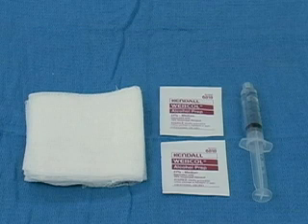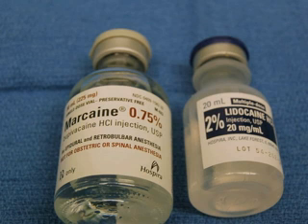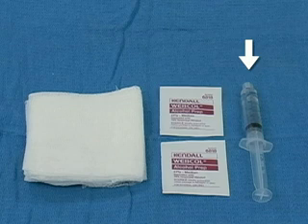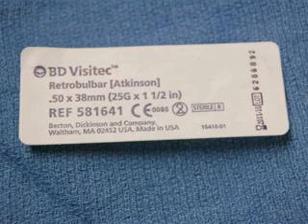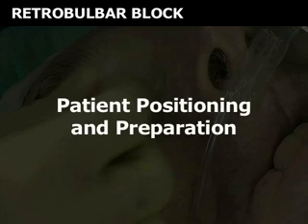Obtain and set up all necessary equipment for the retrobulbar block prior to beginning the procedure. Lay out several alcohol wipes and 4x4 cotton gauze squares. You will need local anesthetic for infiltration into the orbital muscle cone. Here we have drawn up a 50-50 mixture of 2% lidocaine and 0.75% Marcaine in a 5 milliliter syringe. Use an Atkinson 25-gauge retrobulbar needle with blunt tip for injection.